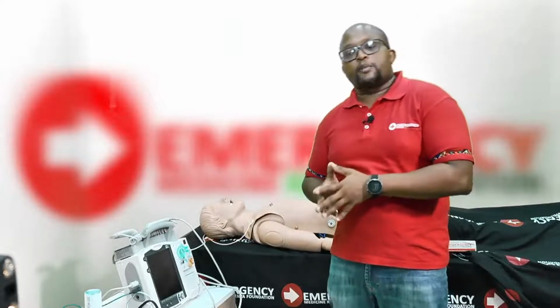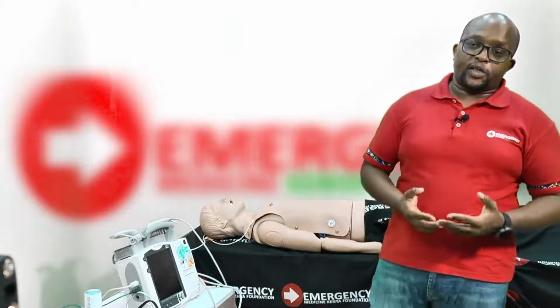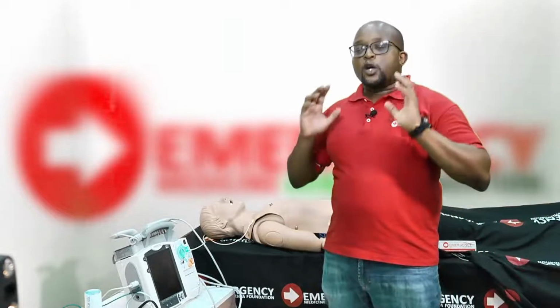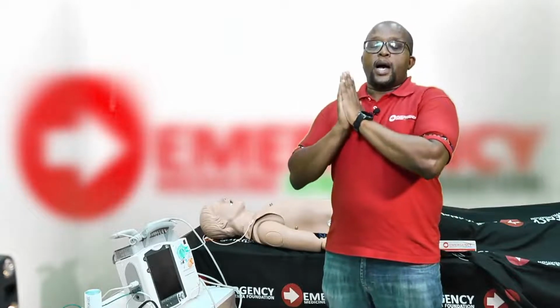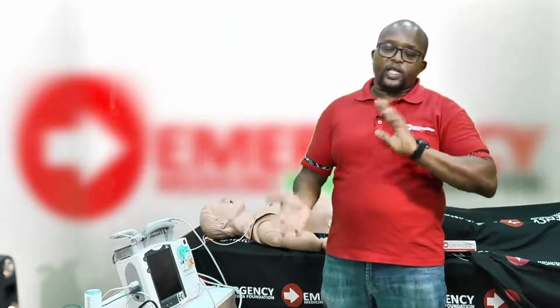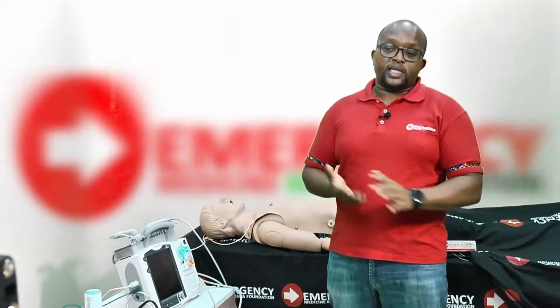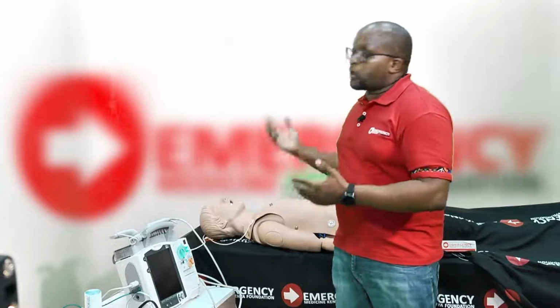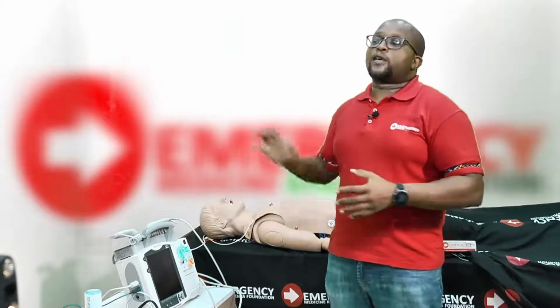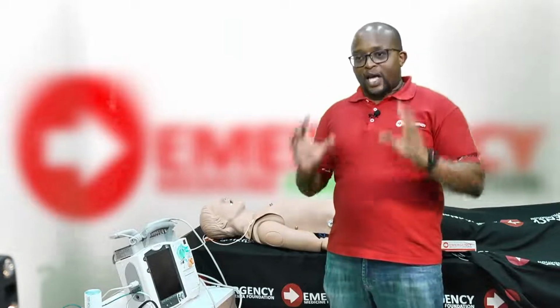Now, there are two things that have been shown to improve patient survival in a cardiac arrest situation. The first is good CPR. Push hard and push fast, but not too fast: 100 to 120 beats per minute, at least 2 inches or 5 centimeters deep, minimize interruptions, allow full chest recoil when doing your chest compressions, and of course avoid hyperventilation. Those are the key aspects of good CPR, and that plus early defibrillation.